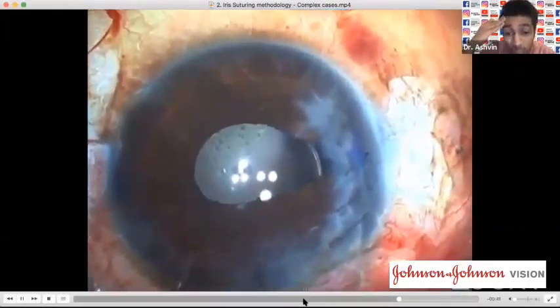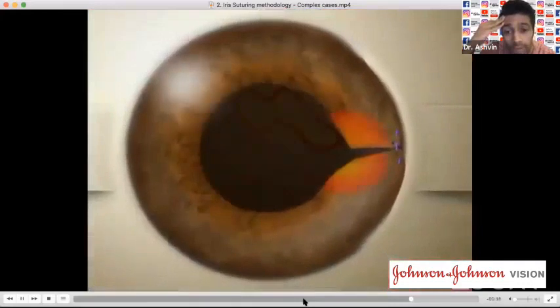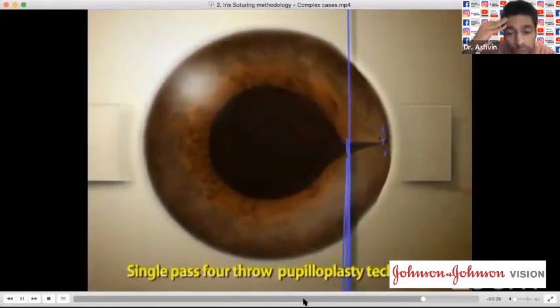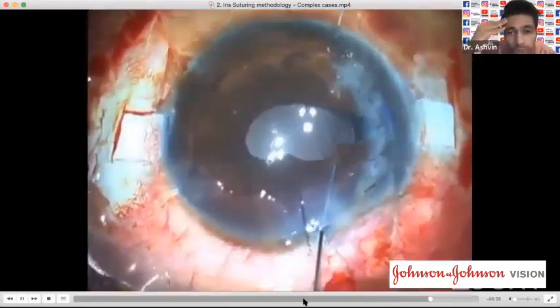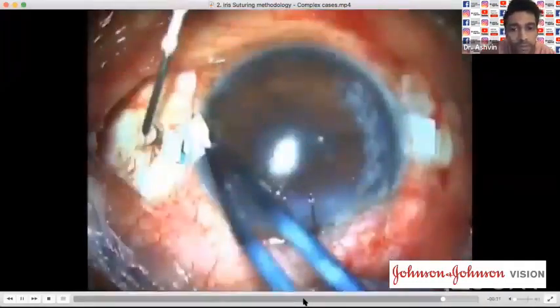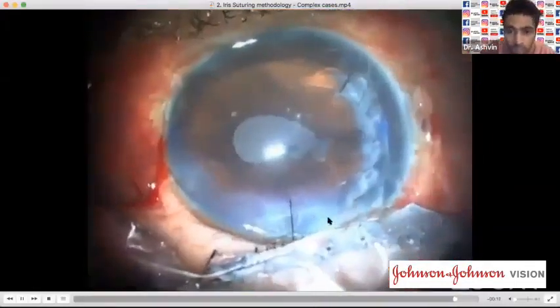But is this case over? I feel that that optic was actually disturbing me at many levels. So I really went back ahead because these pupil leaflets were actually still left aside. And the methodology here, step 1, step 2, step 3, were very different in each of the cases. What I really want to show you guys is the method may be different, but the approach has to be that you really need to sit and analyze each of these cases one by one before you go and solve them.